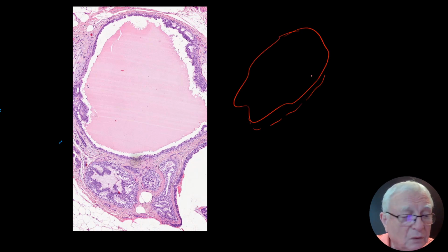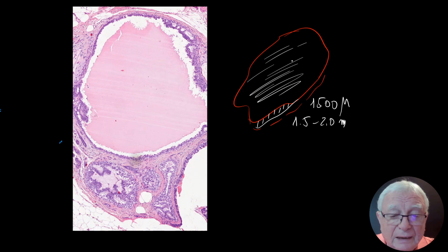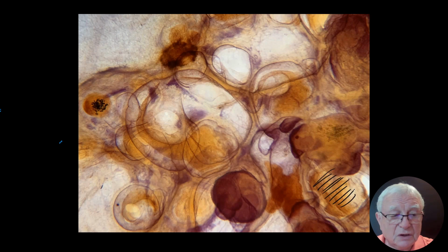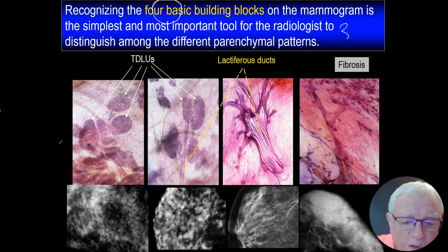and diligent histopathology technologists sliced 1.5 to 2 millimeter sections. And then the cells are gone. And imagine what's left. The three-dimensional histology. When I'm saying a duct, you see a tube. But I see spherical cavities here. Cyst-like structures. Actually, this is a Swiss cheese disease. I promise to you, we are going to look at normal mammograms. There are 4 basic building blocks. I'm only using 3D. No cells, but structure.